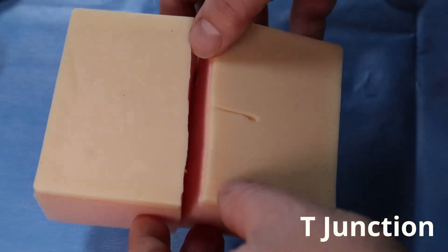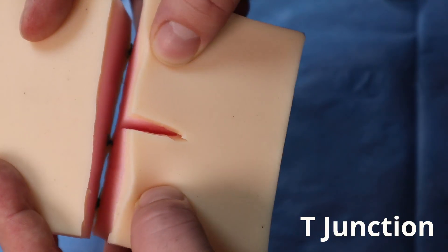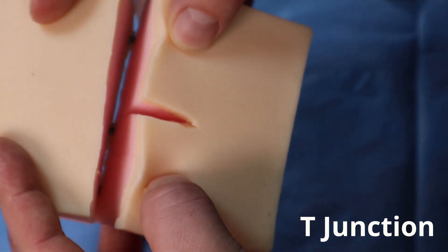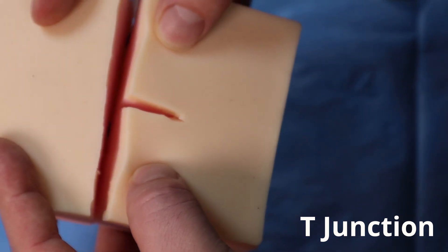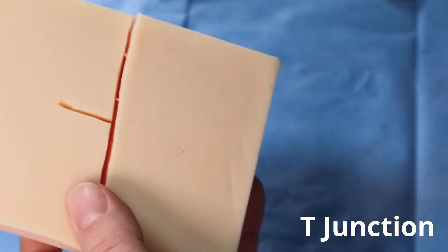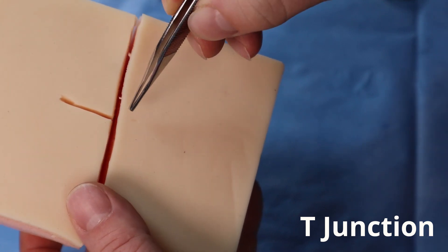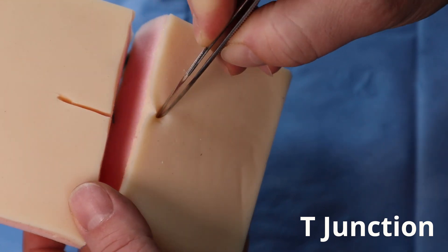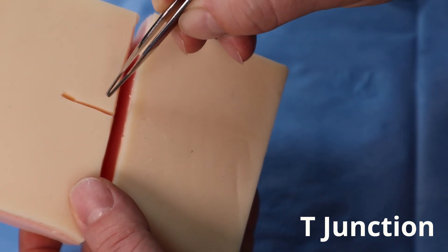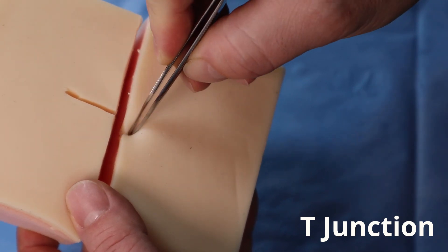All right, what do we have here? I've taken this foam and cut it into a T. You can see I've made a T-type incision, and we're going to repair that. Actually, I'm going to invert it — it might be simpler to understand. So I'm going to have four points of interest on this. Here's where I'm going to insert, then I'm going to come across to this point — here and here. So we have four points. You need to bring all those points together.